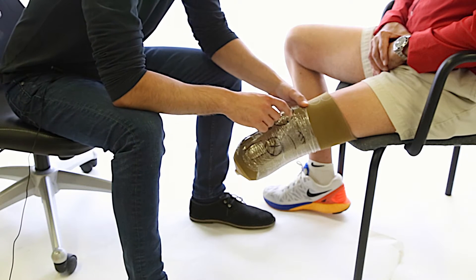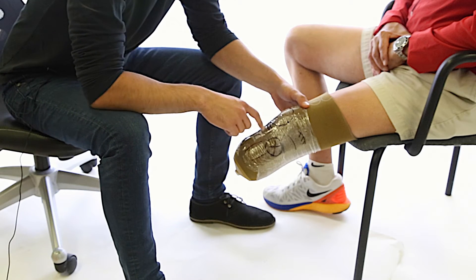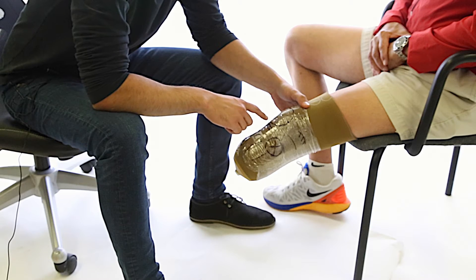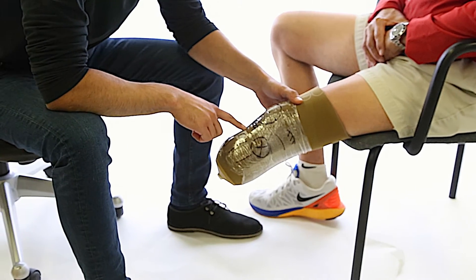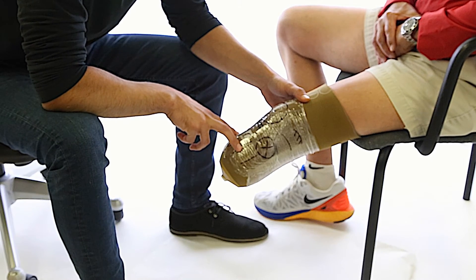On the limb, we should mark the edges of the patella, the mid-patellar tendon, the fibular head, and the anterior tibia.